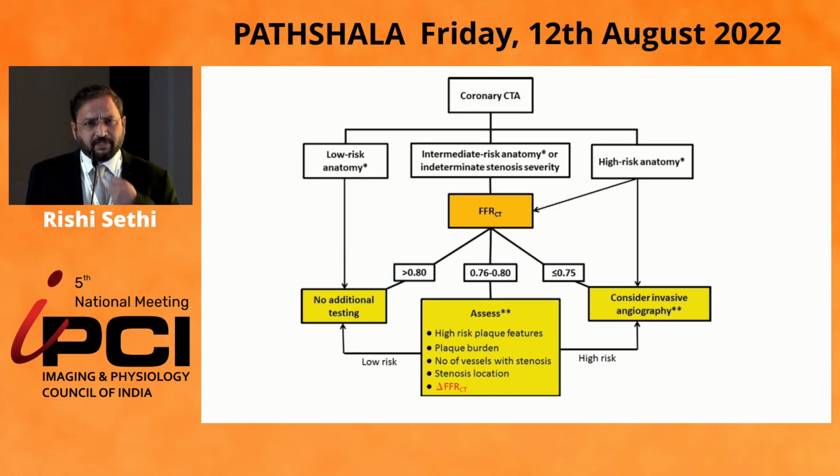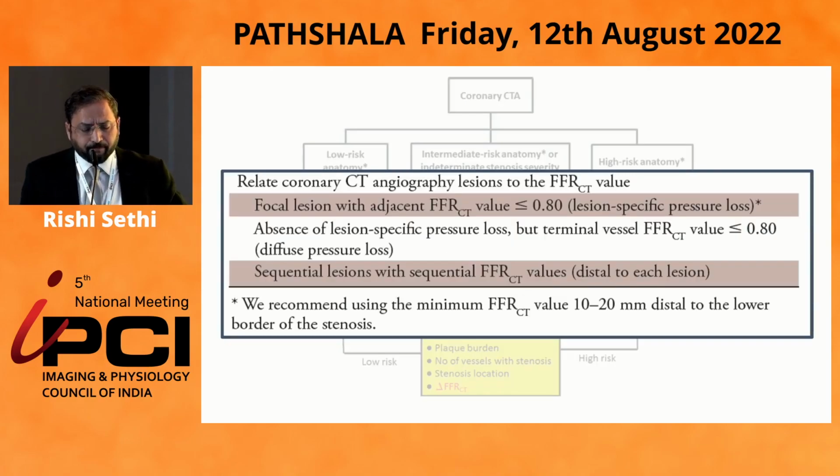Another advantage of a CT angiogram-based FFR is that it is non-invasive, but it also gives the individual value for every single vessel, while with invasive FFR, you can only interrogate one vessel at a time.